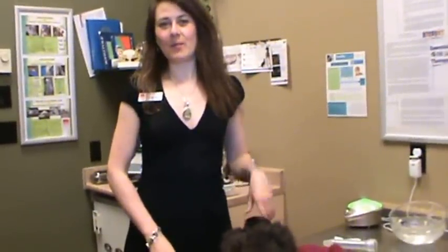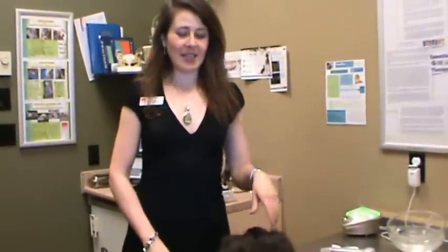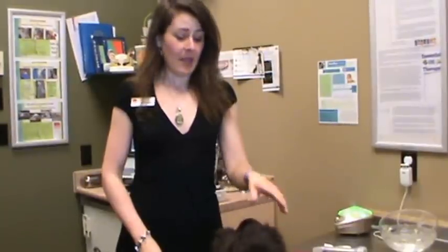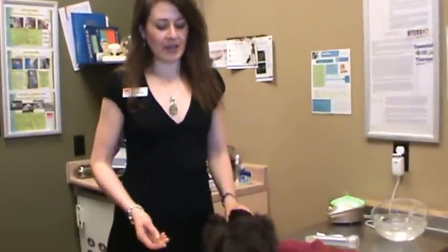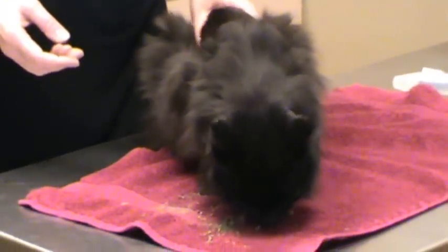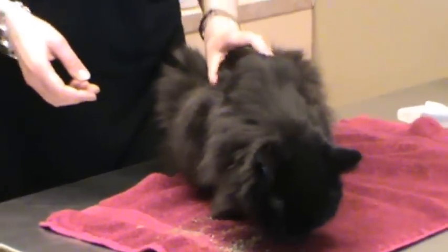Hello, I'm Dr. Julie Schell from Bow Bottom Veterinary Hospital and today I'm going to demonstrate how to give subcutaneous fluids to a cat. This here is Shaka and he has chronic renal failure. His kidneys aren't working very well. He's also a bit dehydrated and constipated so we're going to be giving him fluids.